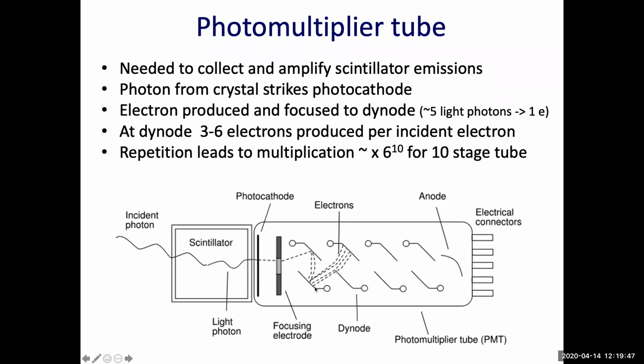So between this dynode and this dynode, there is a different potential. For example, here 50, here 150, here 250, 300. So there are different voltages just to attract electrons from one dynode to another dynode. So the total electron multiplication factor is very large at the end after this amplification. The electron hits this one, is amplified, and comes here. So every time it hits a dynode, the multiplication process is repeated and repeated until we get to the end of the PMT and we get the signal.